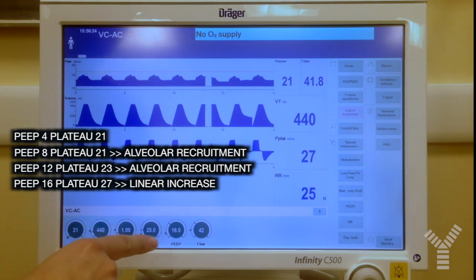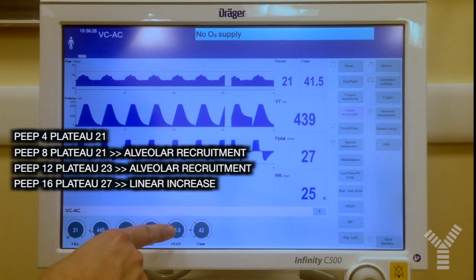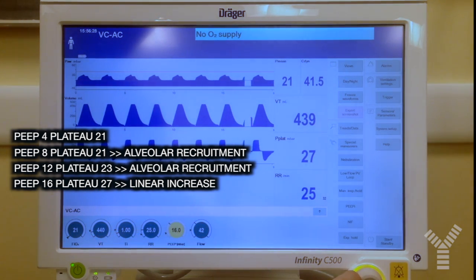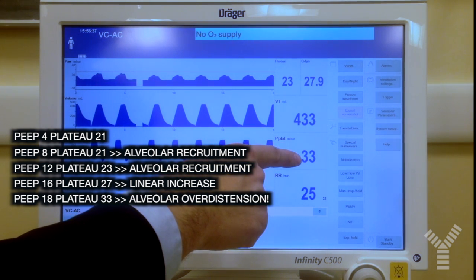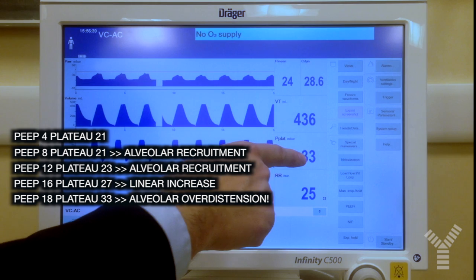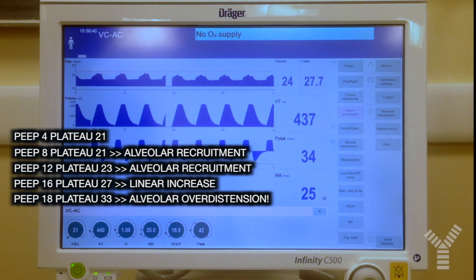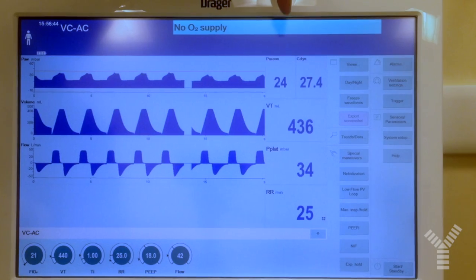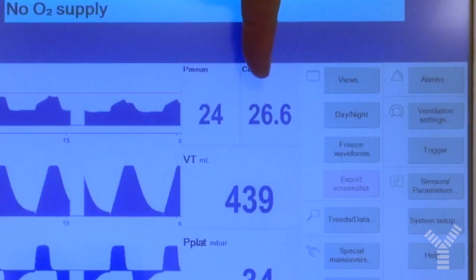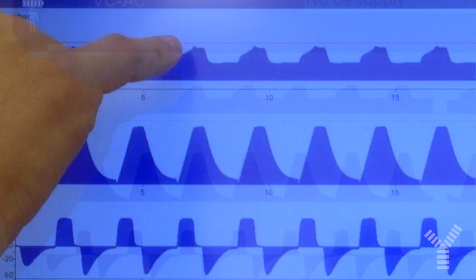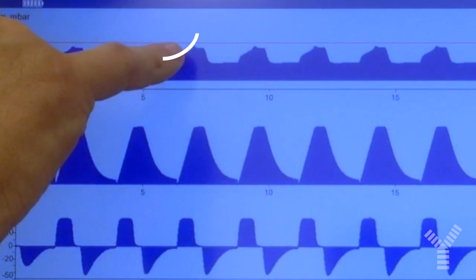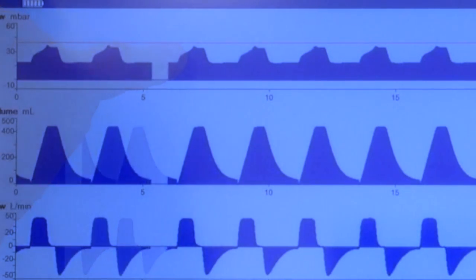But if we increase PEEP further by only 2 cmH₂O, plateau pressure increases by 6 cmH₂O, which likely indicates overdistension. This can also be seen from the decrease of dynamic compliance and from the typical shape with an upward concavity in the pressure-time curve.